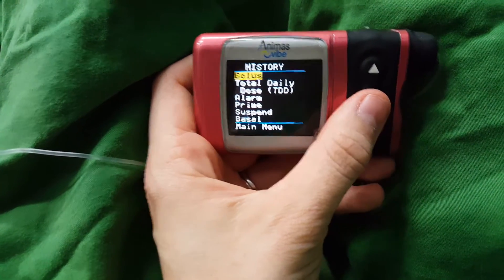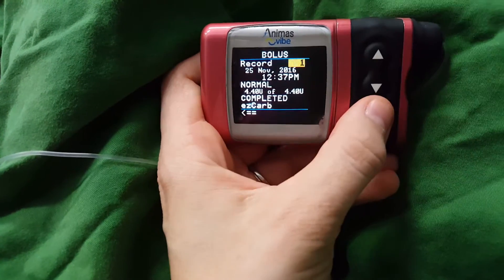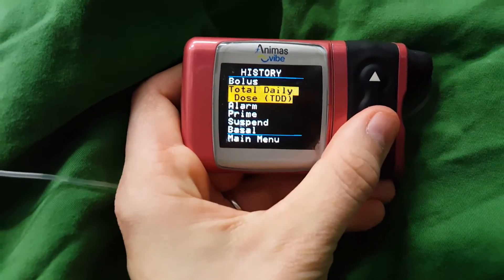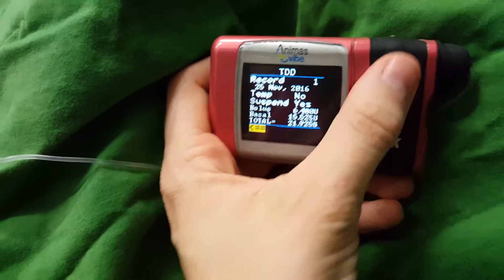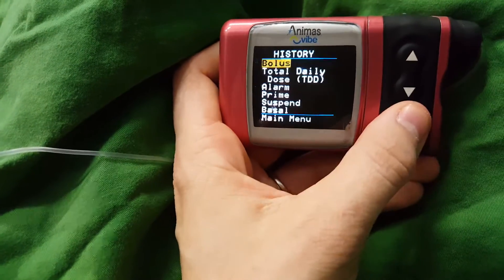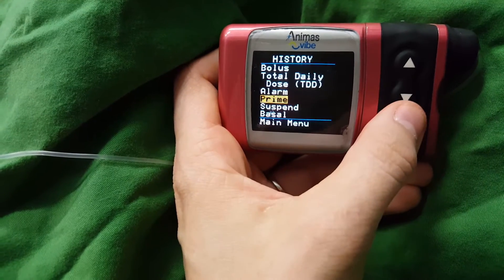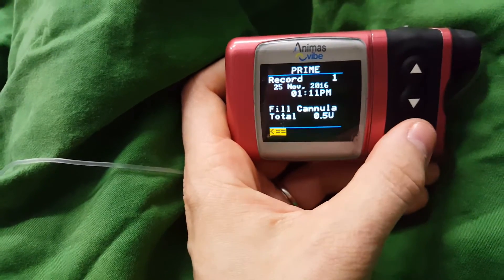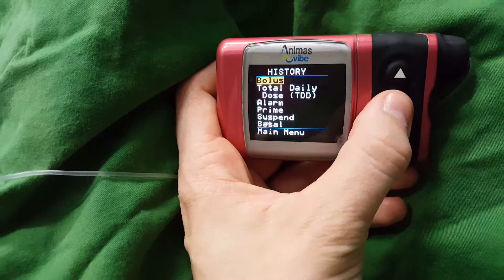History is really handy because if you get mum brain and you can't remember if you've bolused for something you've eaten or if you've corrected, you go in there and it has the records of what you've done. Total daily dose is really useful as well — it'll show your history of what your total daily dose is. For today, 21.92 units so far; yesterday 43; day before 33. All depends on what your glucose levels have been doing and what you eat. It'll also show you a history of your alarms — I had a low battery this morning, which I replaced. It'll also show you when you last primed, which is filling the cannula and tubing with insulin, and history of your basal rates, which is really, really handy.